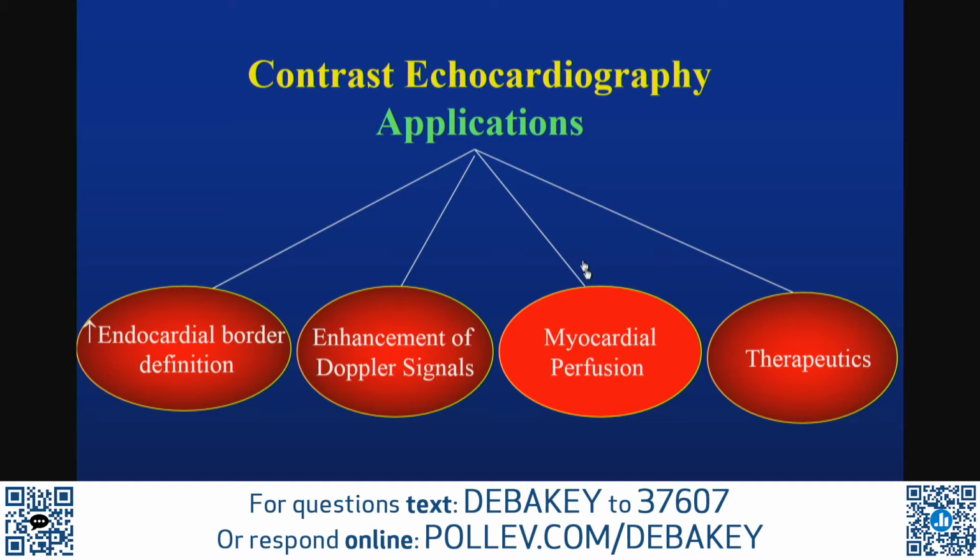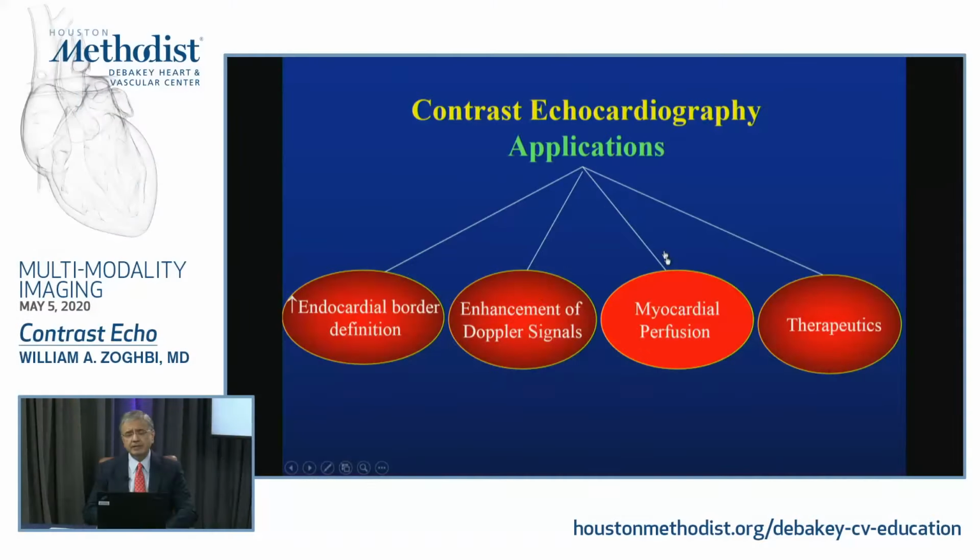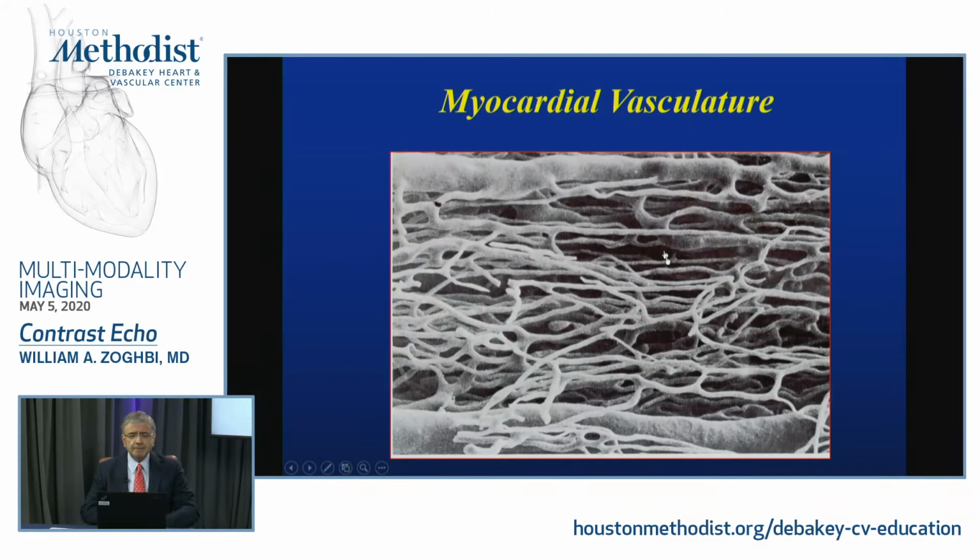And last, I think in the last few slides, we'll touch upon myocardial perfusion because it's interesting. People have done, and we have done, years of research in this area. We have a modifier for CMS for billing, but to tell you the truth, we're not using this. We used it a lot for research. It's great for research, but from a clinical point of view, it has some issues. But let's go through some principles.